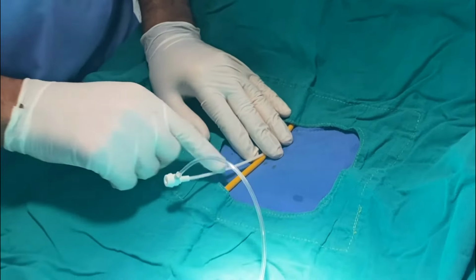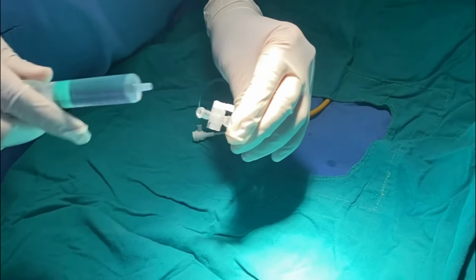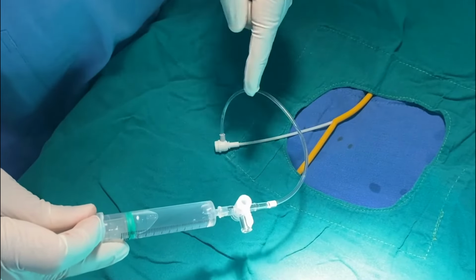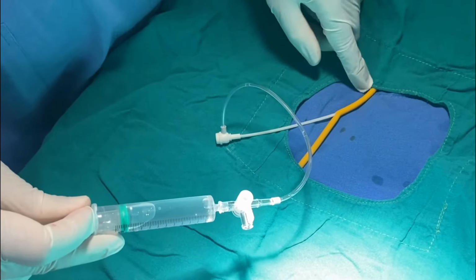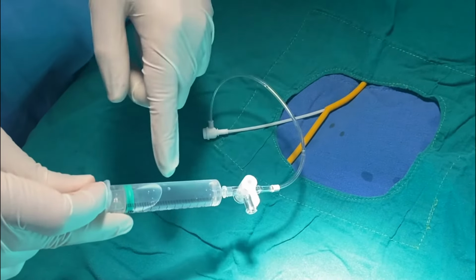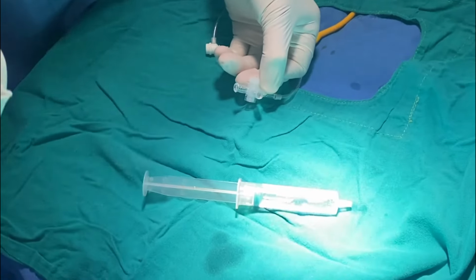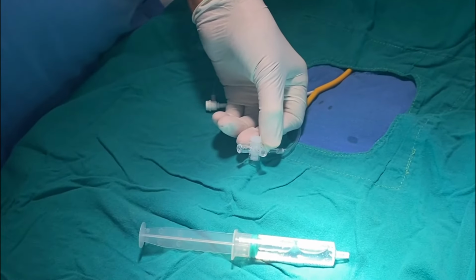The next step, once the sheath is completely inside, is to take a syringe, attach it here, and then aspirate. When you aspirate, there should be a free flow of blood. If there is any occlusion, that means the tip is touching somewhere, or it has dissected the vessel. So always before injecting, aspirate and see whether there is a free flow of blood. Once there is a free flow of blood, close it and just flush it and see if there is any clot or anything. Then take 2500 units of heparin and inject it.